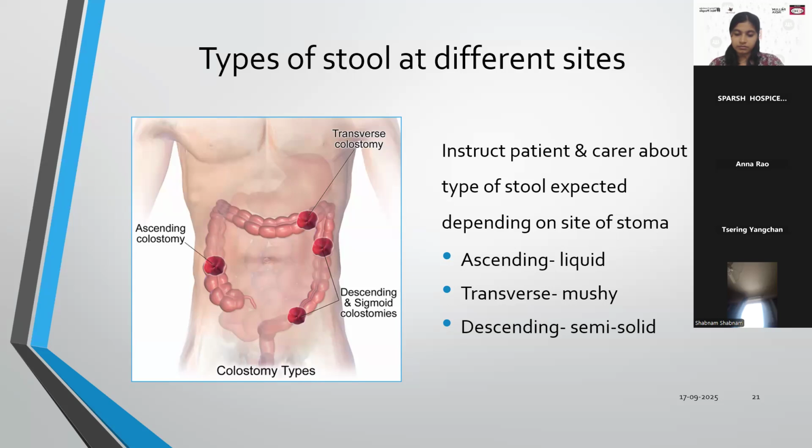Now first we will see how to apply the pouch. Patient can sit or stand, whatever is comfortable for the patient. He can take the position to apply new pouch, and first remove and then apply the new pouch. Generally, the pouch is changed once it is 1/3 full. If they wait till it is full, then what will happen? Along with the fecal material, there may be gas also, there may be mucus also. Because of the weight, the pouch will come off. So they should be told that once it is 1/3 full, it should be changed.